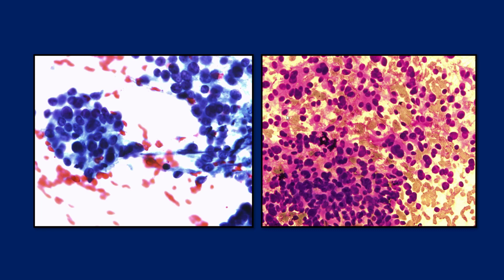This is a lesion which looks ominous, like a salivary gland lesion. You have once again a tumor near the angle of the mandible, sent as possibly a salivary gland lesion, or is it a lymphoid lesion? Is it a lymph node, soft tissue, whatever? There is a clue.